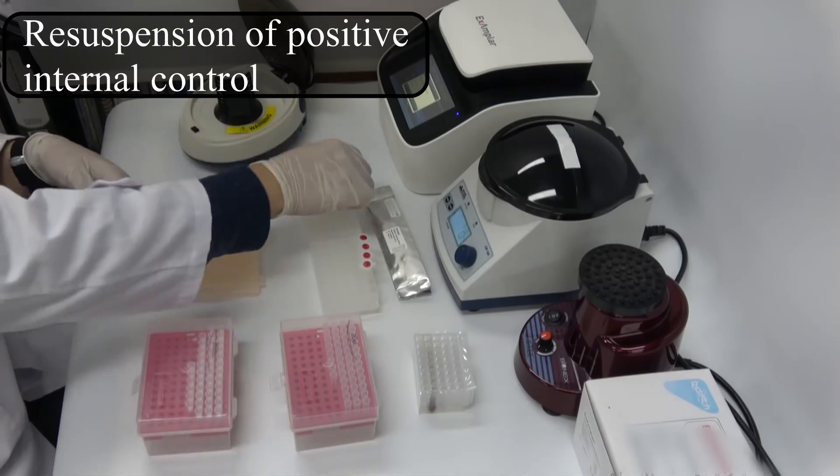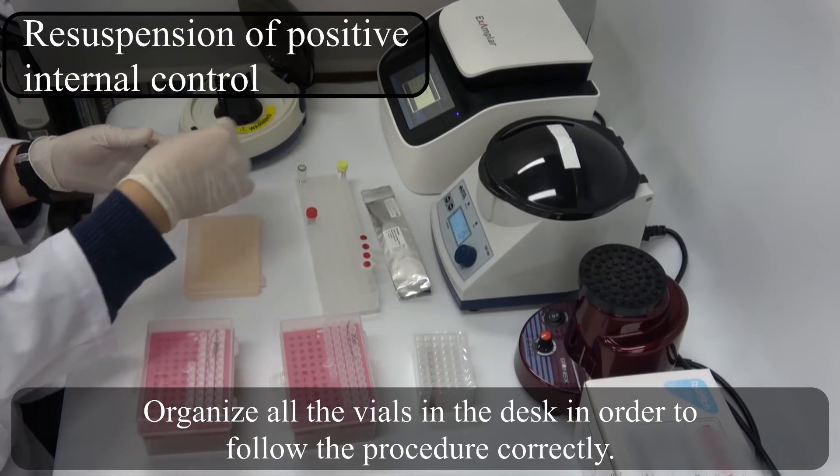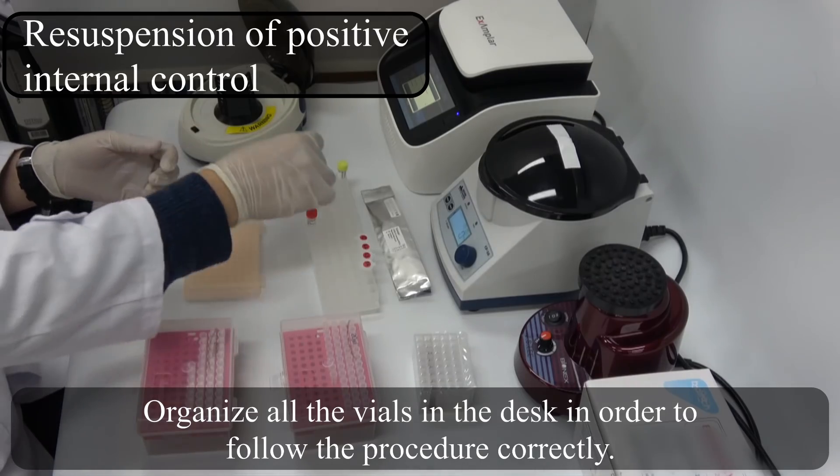Test procedure. Resuspension of positive internal control. Organize all the vials on the desk in the correct order to follow the procedure correctly.